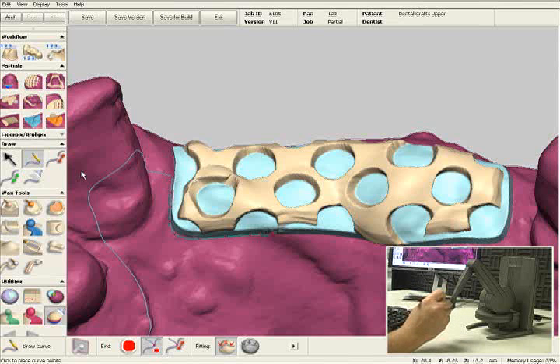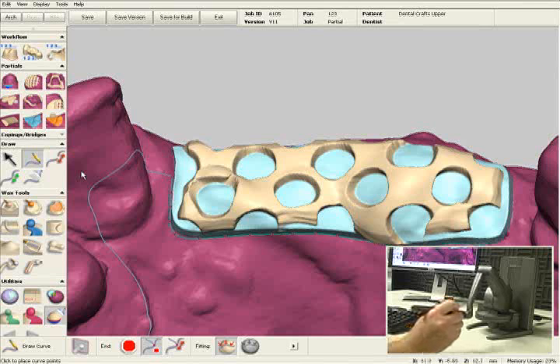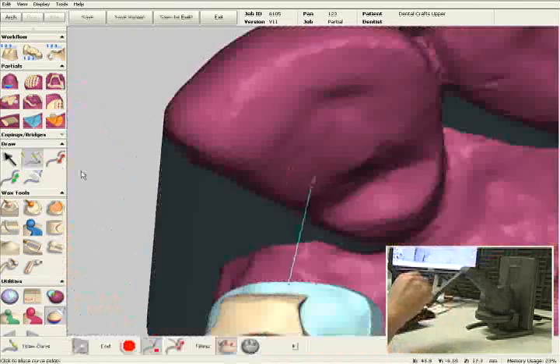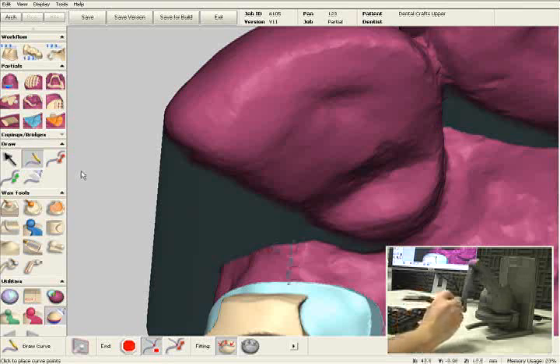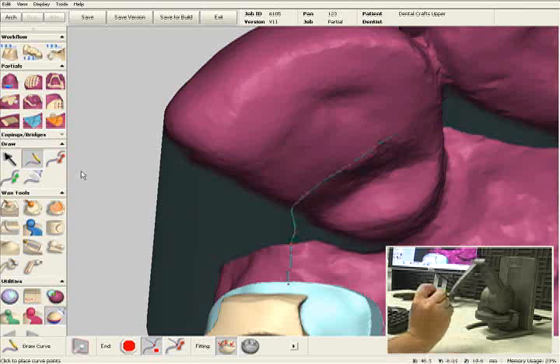You'll also notice that during my design, when I outline the major connector, I bring the outline up onto the lingual plates, rest seats, minor connectors, and guide planes. The reason I do that is I found it will save me a couple of minutes during my partial design if I bring my outline up on all lingual plates and all those areas.